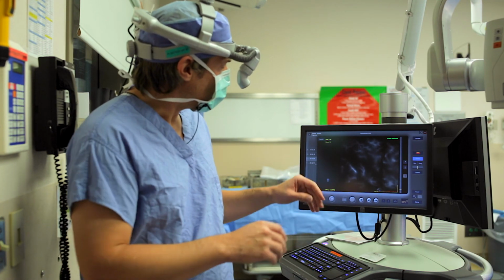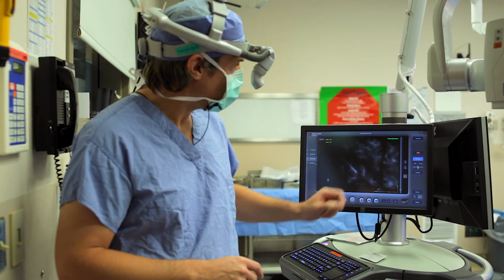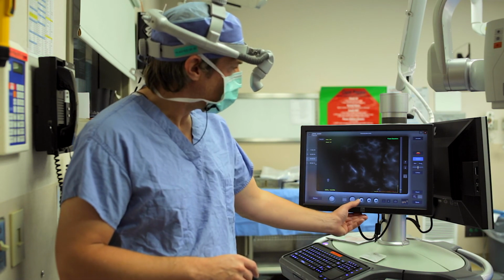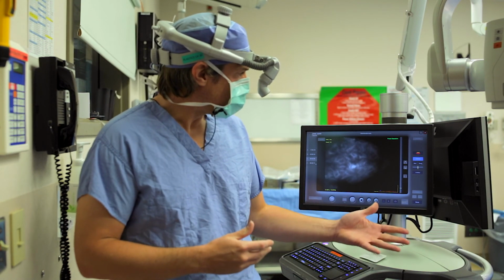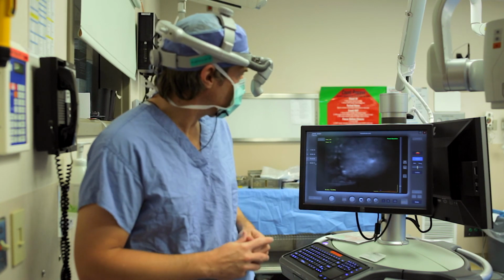With every beat of the heart, just like in that picture that we saw, the flap is here, midline is here, the former belly button is there. With every pulse of the heart, that dye is perfusing through the cutaneous circulation in that abdominal flap. We can look at the left abdominal flap. We can see great perfusion in this area.